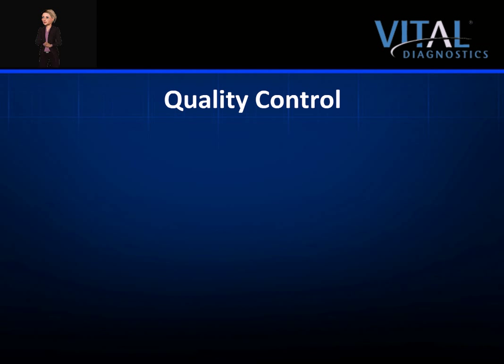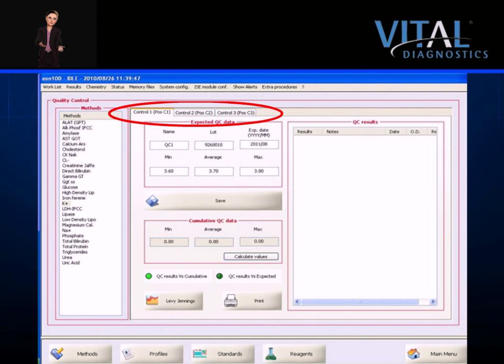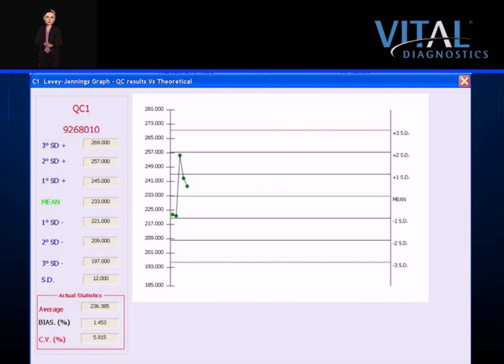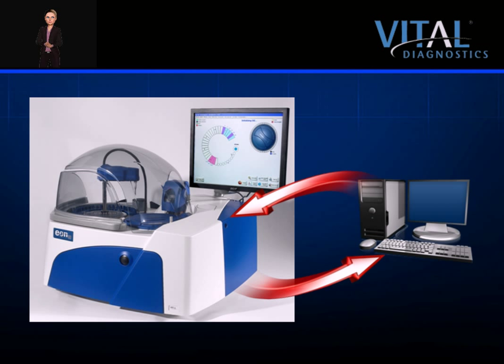In the controls screen, methods are clearly listed on the left side. The instrument can accept ranges for up to three levels of controls, although all current controls used on the EON are bilevel. Theoretical data or expected values are entered under the expected QC data section, and results are stored to the right. Data may be viewed against cumulative data, the laboratory's actual values, or against expected values from the package insert. Levey-Jennings graphs are available for all stored controls and may be viewed or printed based on theoretical ranges or the laboratory's actual data. The instrument features a bi-directional interface to a laboratory information system, and control results can be exported for off-board management.